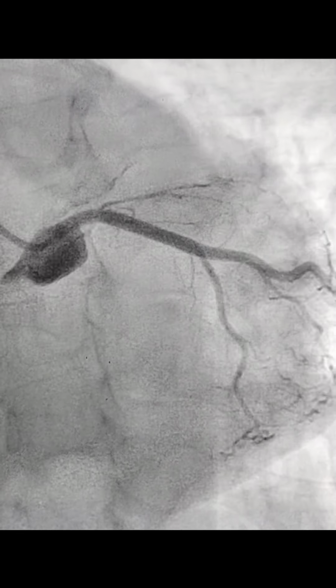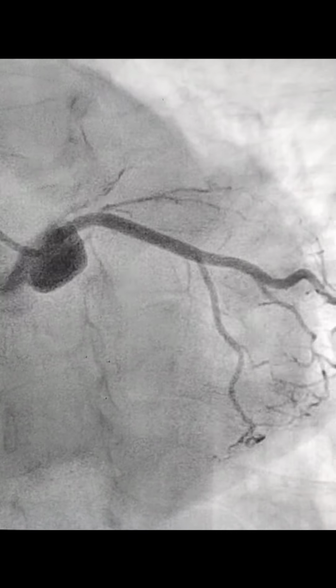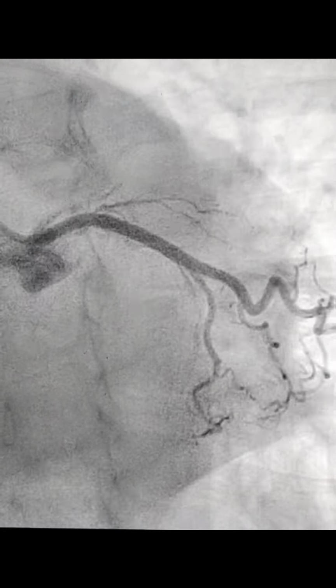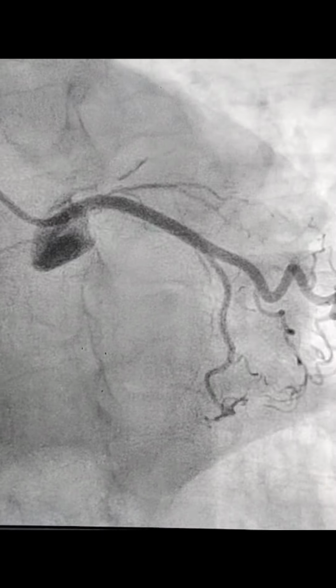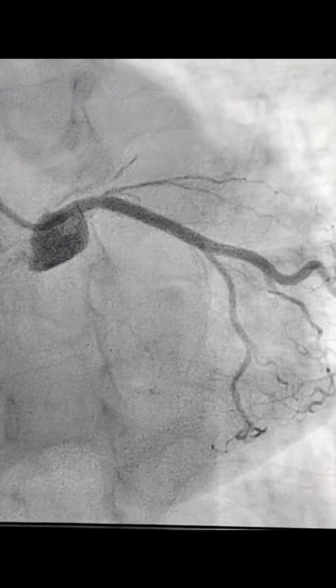So this is a 51-year-old female, known case of diabetes and hypertension, now presented with CAD, ACS, evolved anterior wall ST elevation MI. After 6 to 7 hours of chest pain, she presented to hospital, and this is the picture.